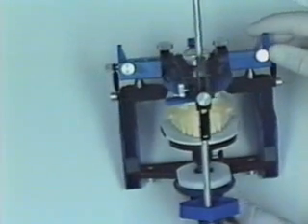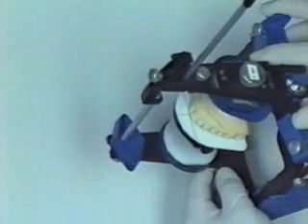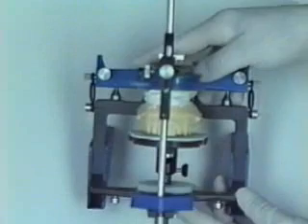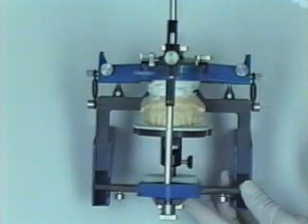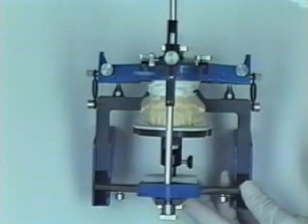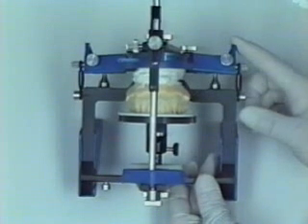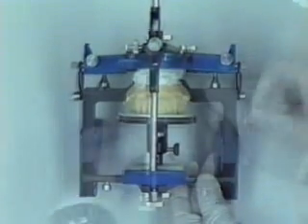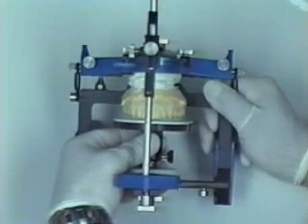Once the pin is reset to zero, the position of the maxillary incisal edge has been recorded exactly. In addition, the maxillary occlusal plane can be visualized in terms of how level it is in the face, both left to right and front to back. If the clinician has decided to increase the length of the maxillary incisal edge two millimeters, the dial gauge is now positioned two millimeters more open.